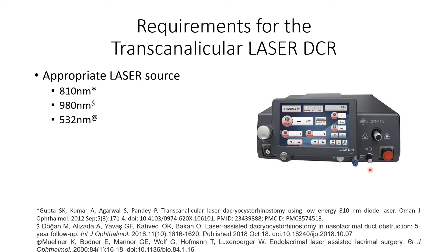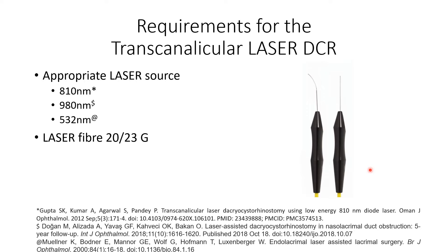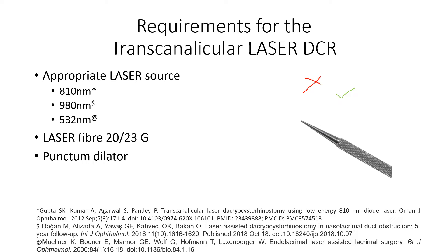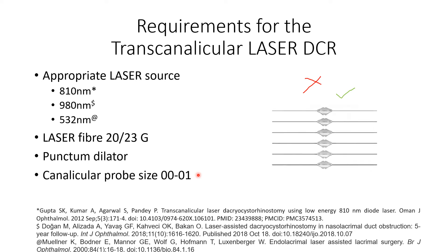We need a laser fiber, either 20 gauge or 23 gauge. The bent probe is not the one to be used — it is shown only for reference. The straight laser probe, marked here in green, is the correct choice. We also need a punctum dilator — a pointed-tipped metal instrument, also known as Nettleship's punctum dilator — which provides access to the puncta. A canalicular probe in sizes 0-0 to 0-1 is also required.